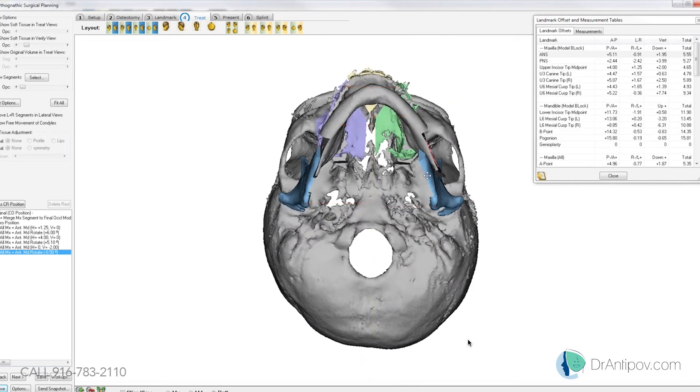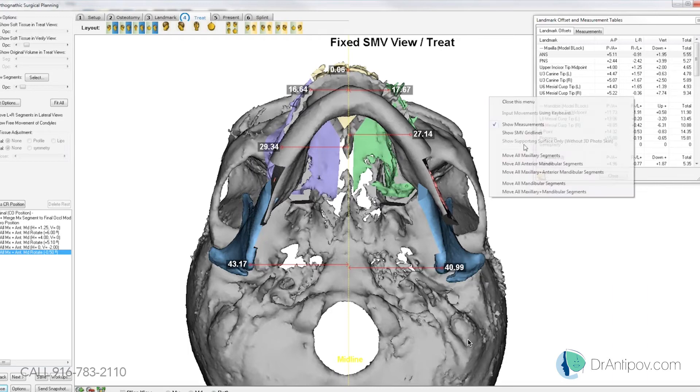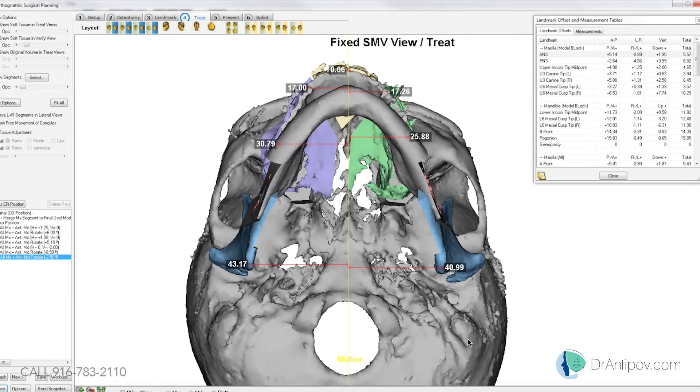I'm just going to go ahead and see if there's any yaw to correct here, which it does look like our left side has flared out quite a bit here in the mandible. We'll do a little bit of clockwise rotation here to kind of help those proximal segments lay nicely.